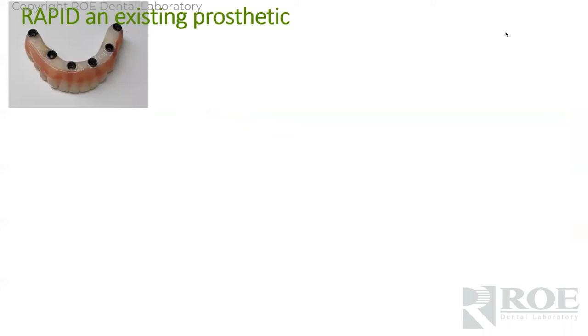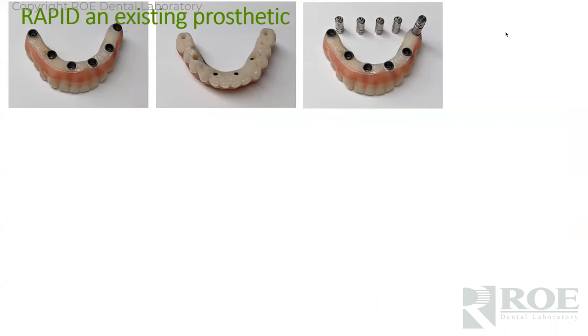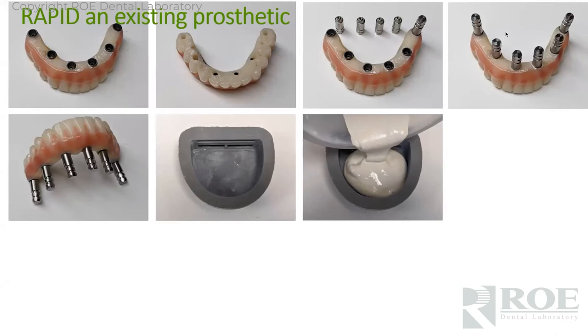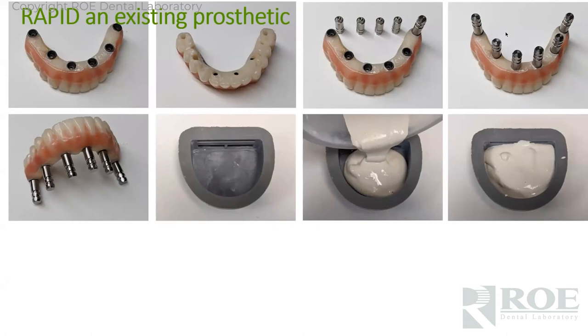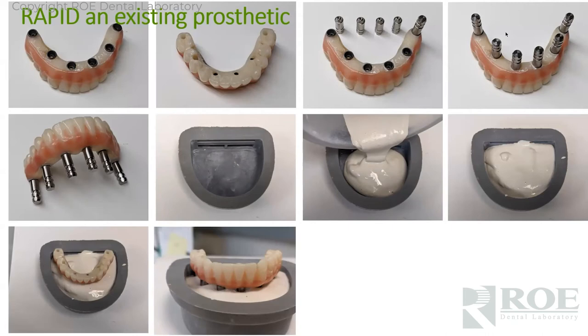Patient comes in with a six-unit lower prosthetic that needs a new one — fracture, teeth worn down, whatever the reason. You'll order the multi-unit abutment analogs from us, the lab, or your rep. Screw them into the prosthetic. Then take your flask, fill it with stone till it's about three-quarters full, and set the multi-unit abutments in stone. Don't let the prosthetic touch the stone — we're not trying to capture the intaglio because there's probably a gap anyway, so it won't tell us anything.